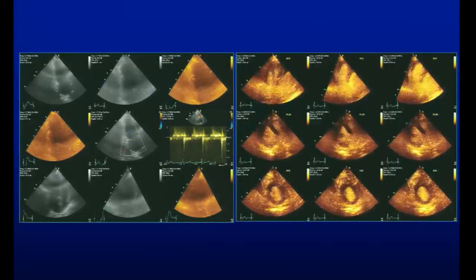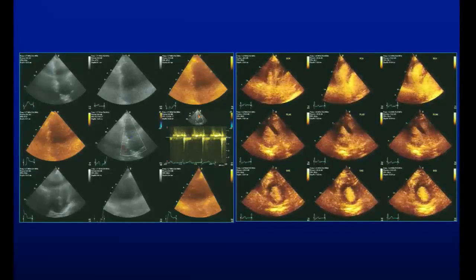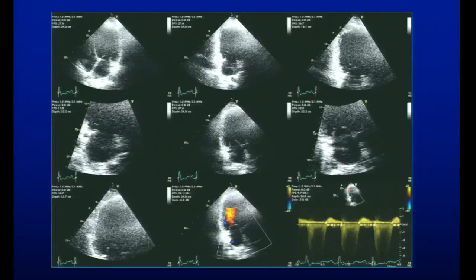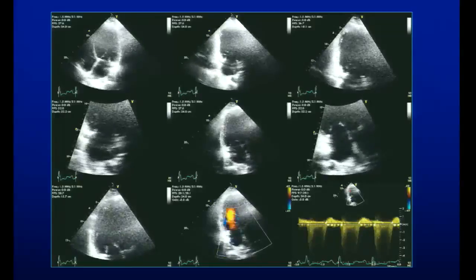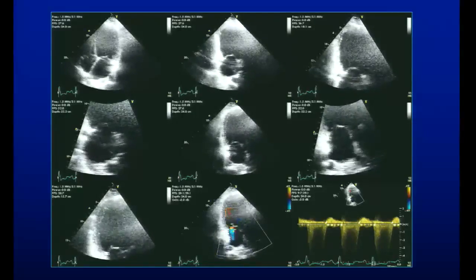And this is that same patient. I mean, like, my goodness, what a difference, right? So it really rescues studies. How about this person? There are a few things that you can interpret. There's no question about it. I can see, and the reason I'm giving you these previews is that I'm not picking just one beat.